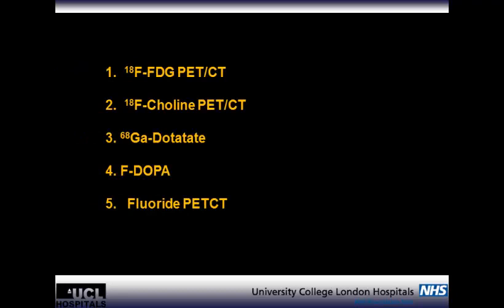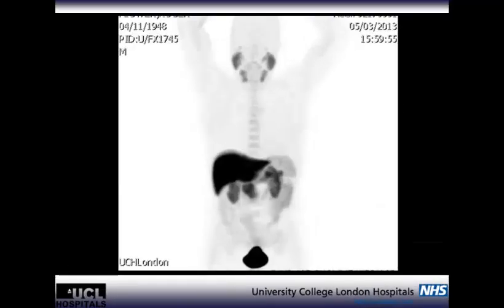So you can vote now, please. Interesting. So if I go back, I think it's choline, and you can see the liver uptake. It sometimes can depict gallium, which could be a good answer, but this is choline. The next one.